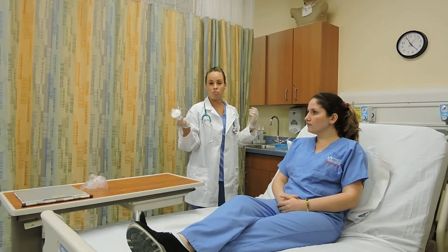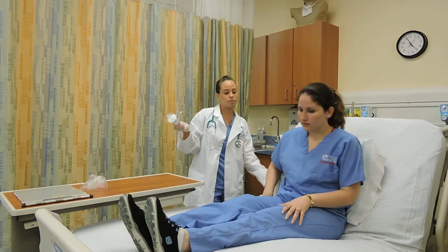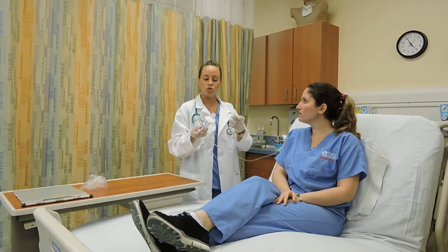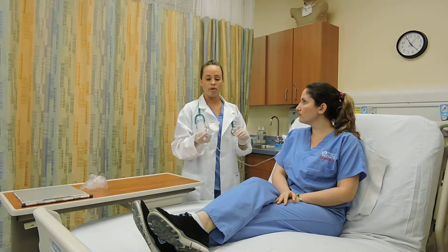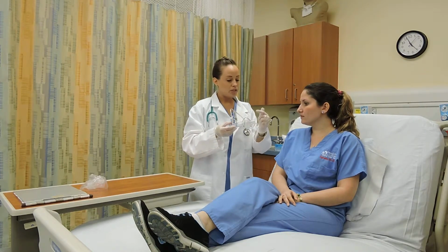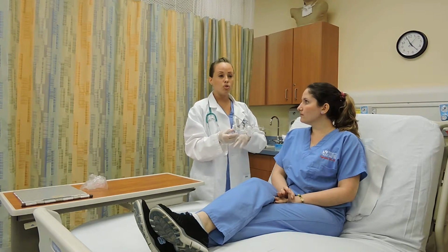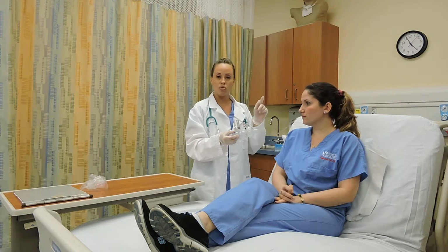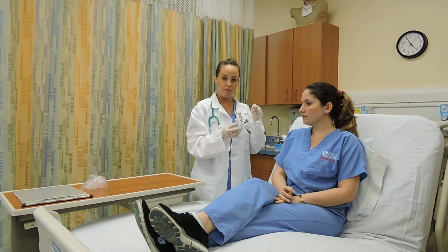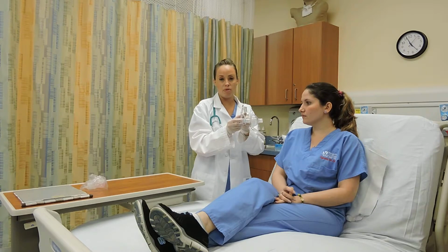Position your patient in the correct position. Ms. Sanchez, I'm going to need you to sit up straight and comfortably. Okay? And then I'm going to proceed to instruct my patients how to use the equipment and how to go through the therapy. This is how we're going to do it. You're going to form a tight seal around the mouthpiece. You're going to inhale from your diaphragm to a volume greater than your tidal volume, but not to your total lung capacity. At the end of inspiration, you're going to exhale through the one-way valve, trying to achieve an airway pressure of 10 to 20 centimeters of water.